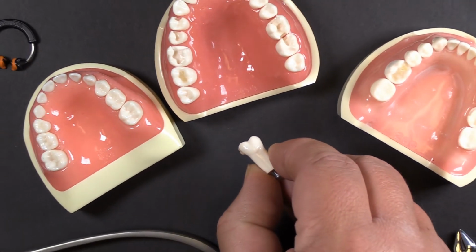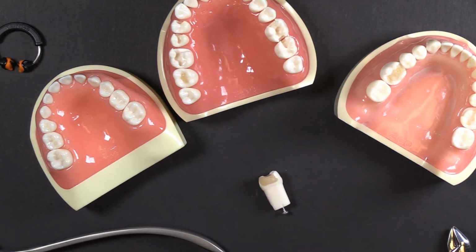Oftentimes, when you see an overhang like that, there is one of two things that have taken place, possibly both of them at the same time. The first being really aggressive wedging. The purpose of the wedge in a sectional matrix system is to seal the bottom of the box. You will get some separation with that, but it's not like when you were using a Tofflemire style band and the wedge was your only thing that was separating the tooth.